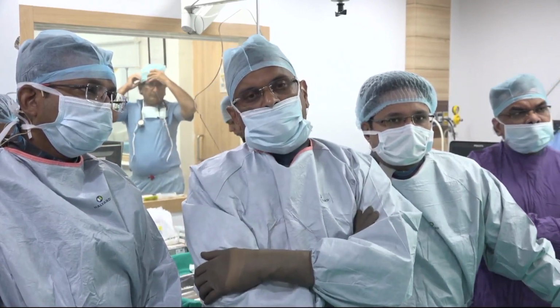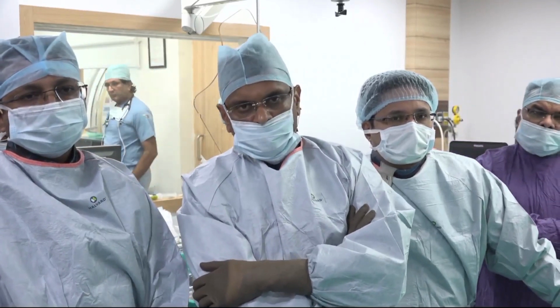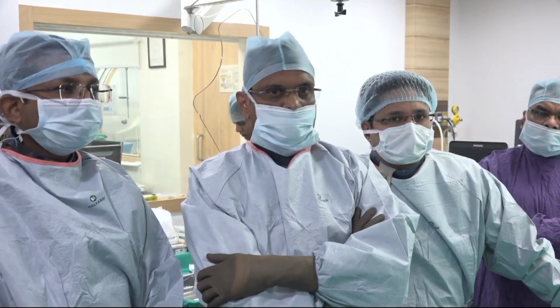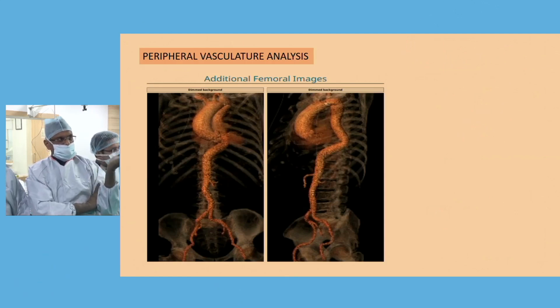We are going to position this valve at 3 to 5 millimeter in the LVOT, so that we negate the chance of any kind of pacemaker. Dr. Gautam has already told that this patient doesn't have any ECG risk for pacemaker, particularly the patient doesn't have any RBBB, which is a very high risk.